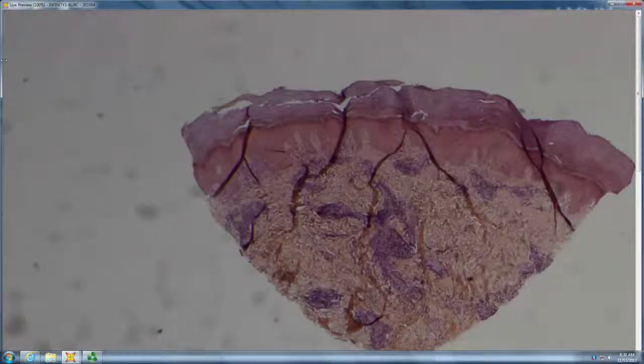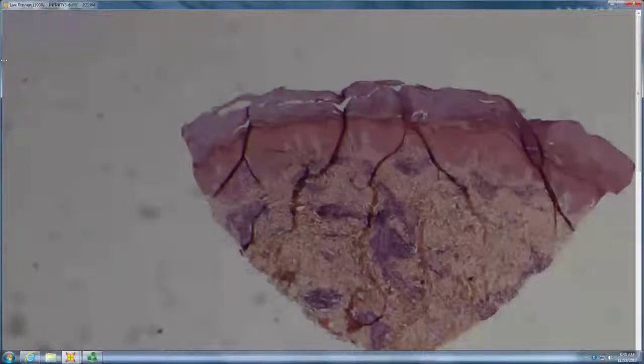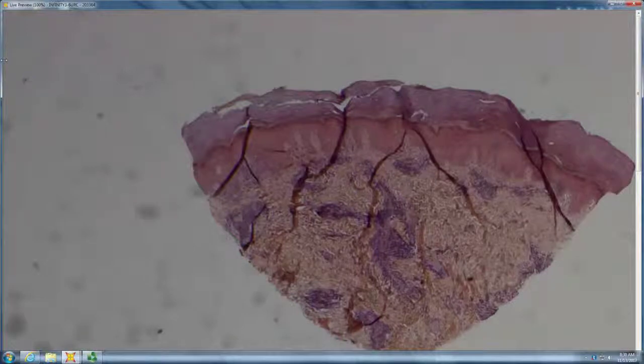So perivascularly, it looks like you've got, or actually more so within the lumen. What's the red thing? EOs. EOs, and what are the things with segmented bodies? Neutrophils. So neutrophils and EOs in the vessel.